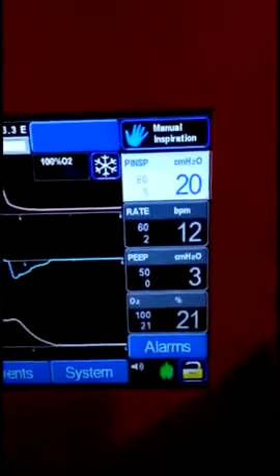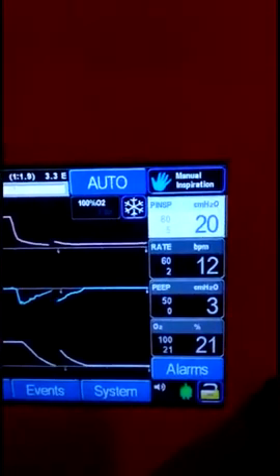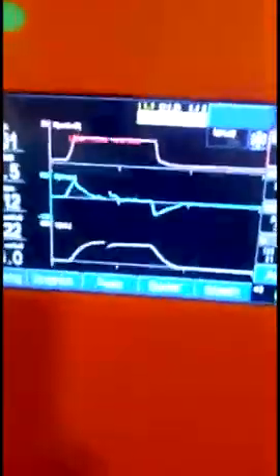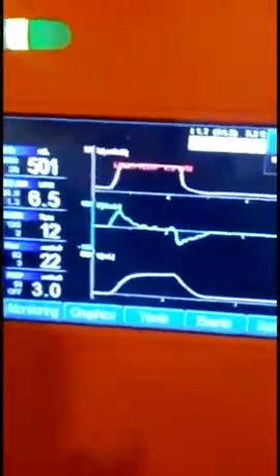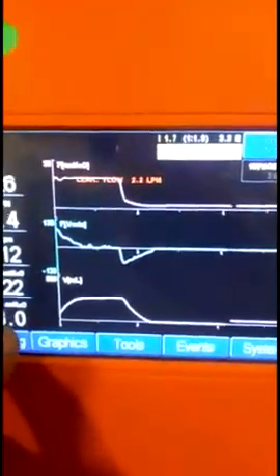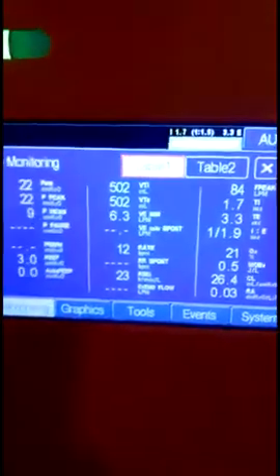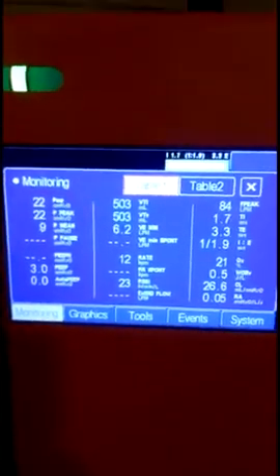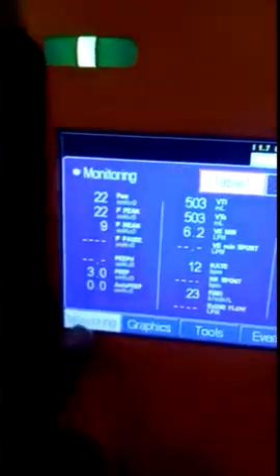This ventilator has a very easy user interface — all the shortcuts are on the front panel. You can view all the monitored parameters and the set parameters. To change a parameter, you can adjust it here using increase or decrease and then press the confirmation button.